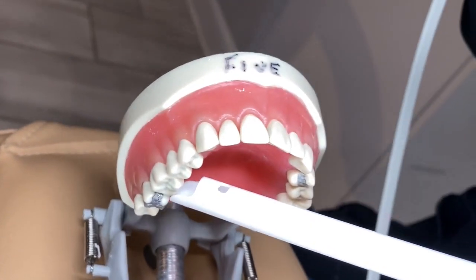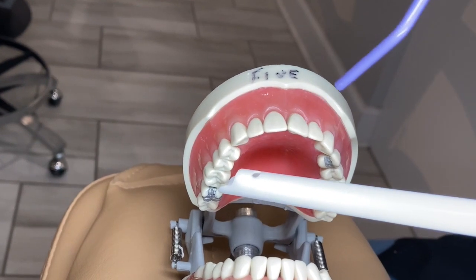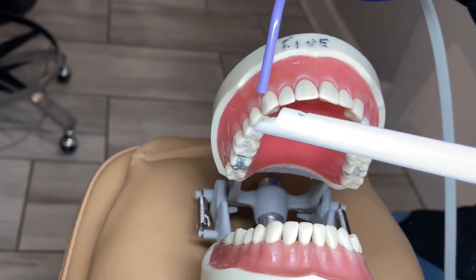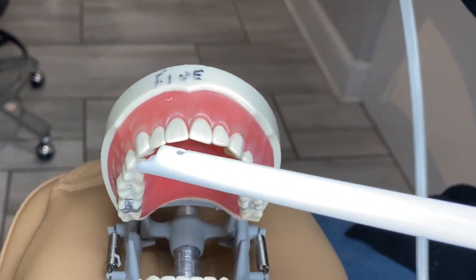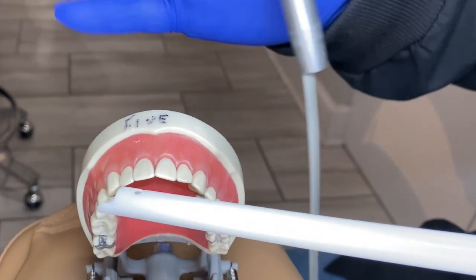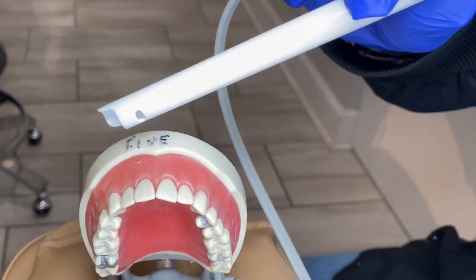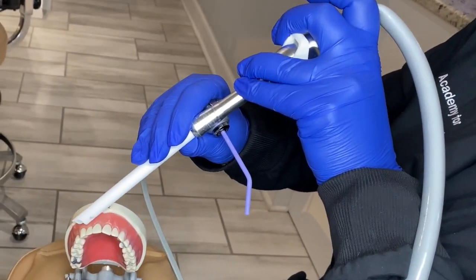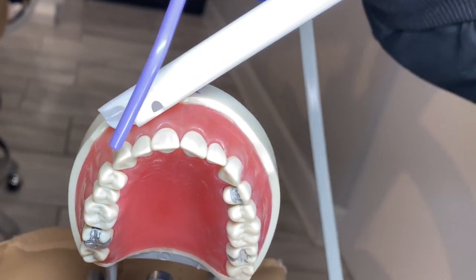As you go around, it's the same thing — if they're on the buccal, you're going to be on the lingual. As we come around to the front, the anterior teeth, the same objective: if the doctor is on the cervical, facial, or incisal, we're going to be on the lingual. Also, if they are on the facial and the water is spraying towards the face, you can turn your suction to catch the spray of the water.